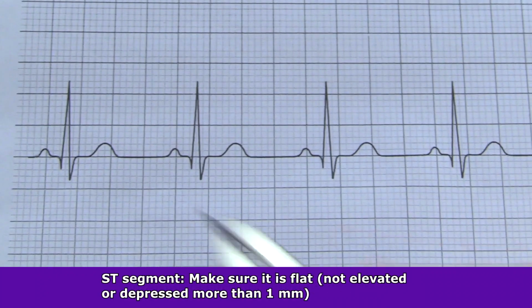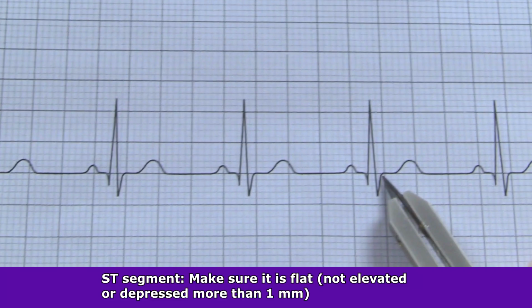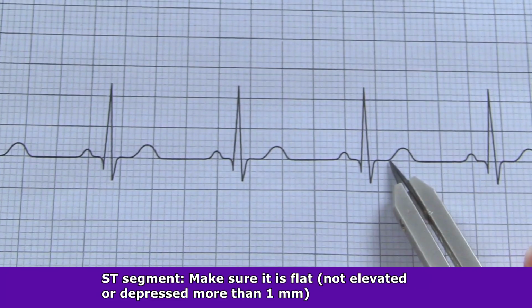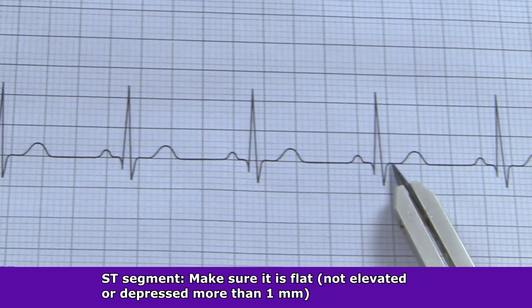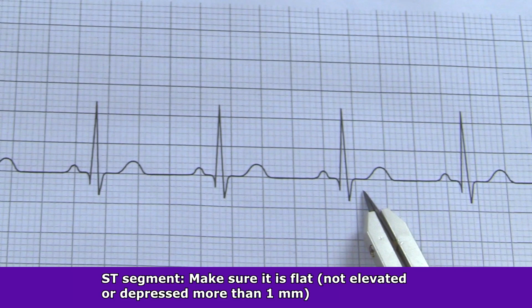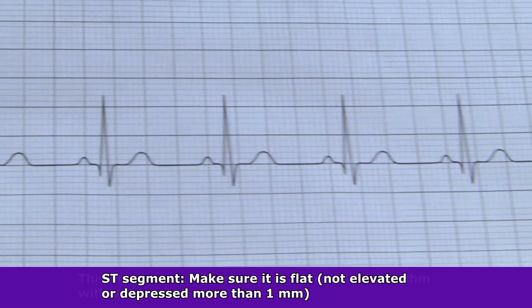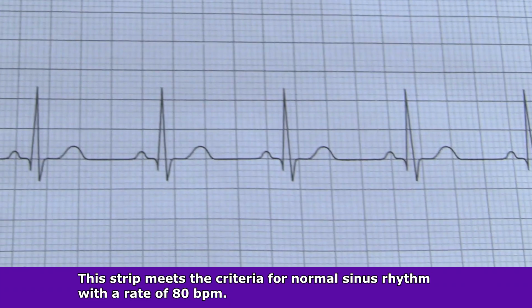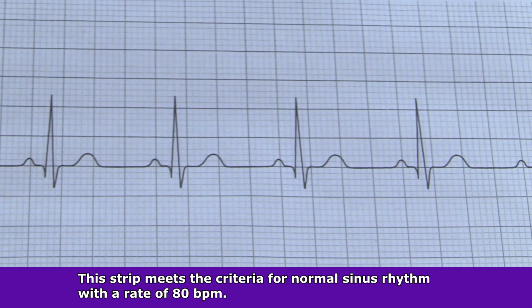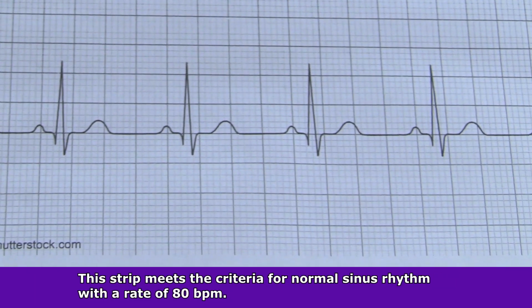And then lastly, we just want to look at the ST segment, which again is found at the end of the QRS complex to the beginning of the T wave, making sure that this area is flat. It's not elevated or depressed more than 1 millimeter. And here that is not. So, with all those questions that we just answered, this rhythm meets all the criteria for normal sinus rhythm with a rate of 80 beats per minute.